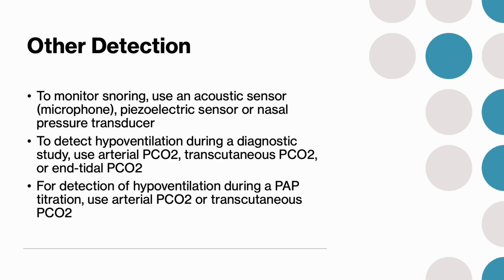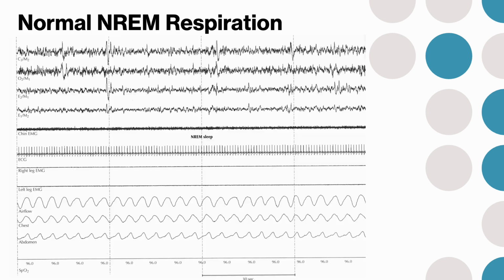Of course, when the patient moves, it doesn't stay, but a lot of labs just don't have the money for transcutaneous machines, and patients are less likely to sleep with an IV and just to collect blood samples, let alone paying a nurse to do it, just for a sleep study.